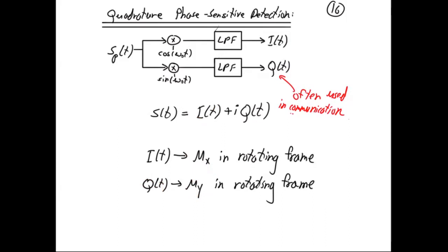And we'll get to this, because the only difference between them is pretty much phase, right? If we have some signal and we multiply it by some phase, then you can shift. The only difference between the I and Q components is a 90-degree phase, in the complex plane.